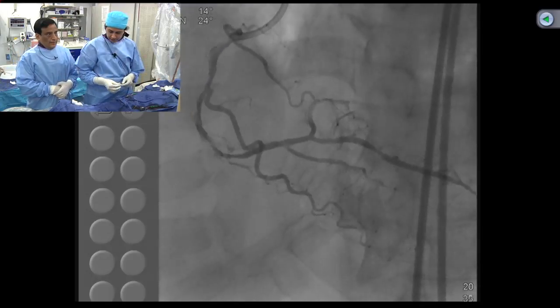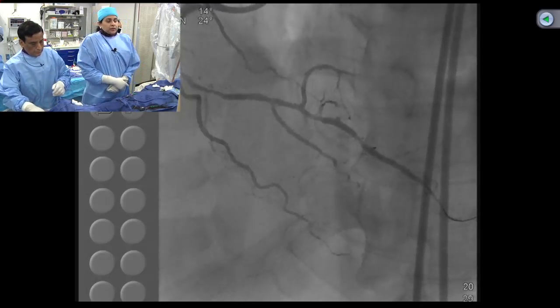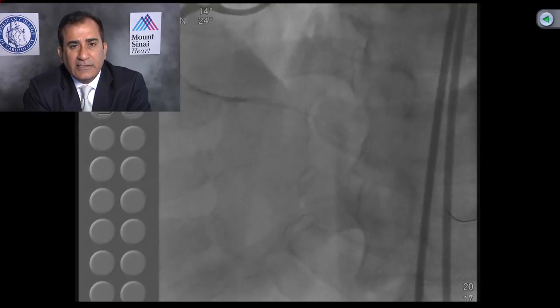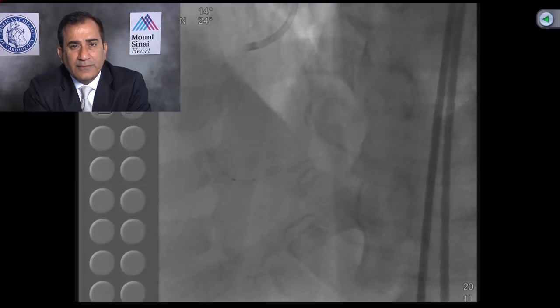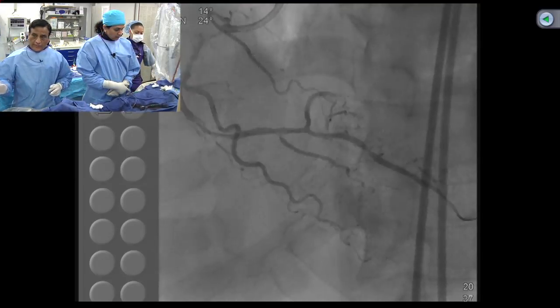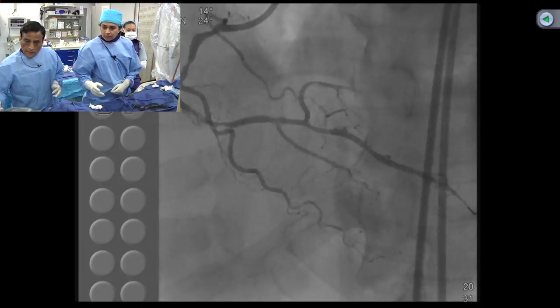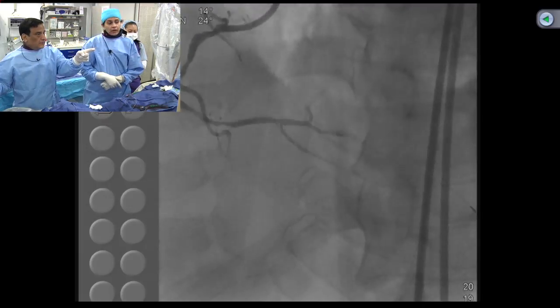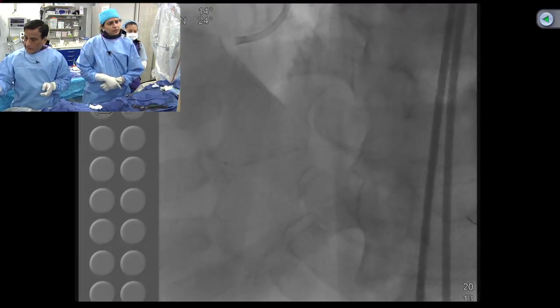Two stents, right? Sameer, question for you, a 2-part question. What is the long-term dual antiplatelet strategy, and how will you follow up this patient? Yeah, this patient actually had symptoms and inferolateral ischemia, as you know, with the guidelines now. Yeah. And then get a 3.0 or 3.5. You want 3 or 3.5? 3.5 for 38.